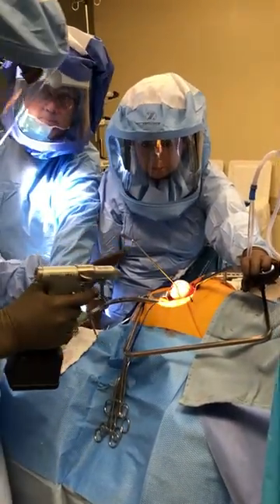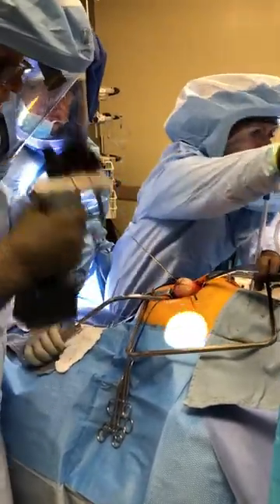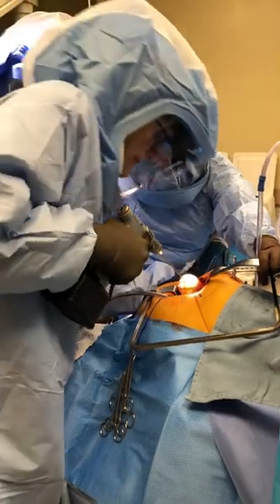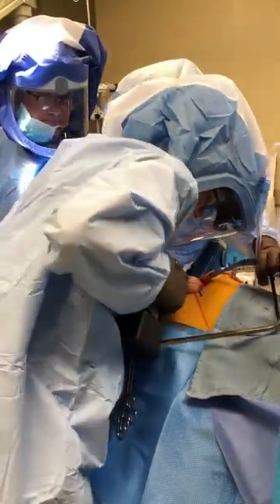So now I've got my head cut set for a guy with no deformity of the head. I'm just going to drive the pin through, and then everything else is just mechanical after this point. You've got great bones — it's 69 with a T-score of 2.6.